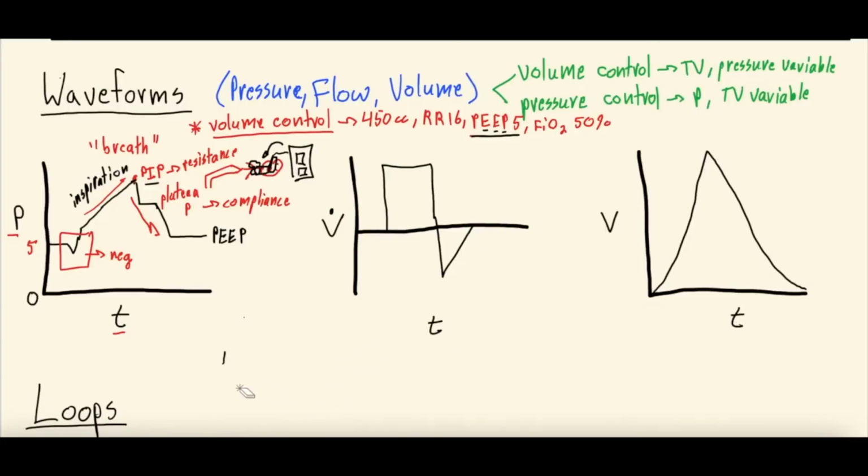All right. In a future video, we're going to talk about how these morphologies change with different kinds of pathophysiologic responses, whether it be flow hunger or breath stacking or ineffective triggering or flow starvation. So look for a future video on that. This is just the introduction.